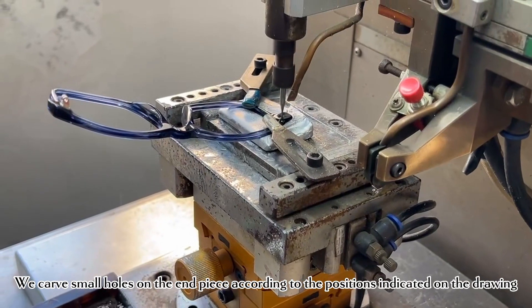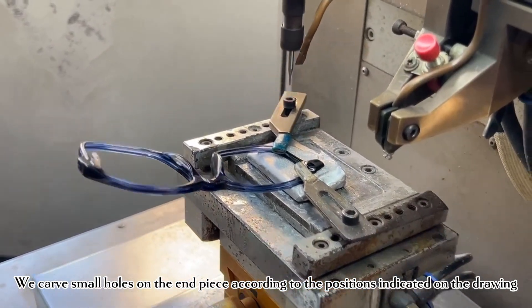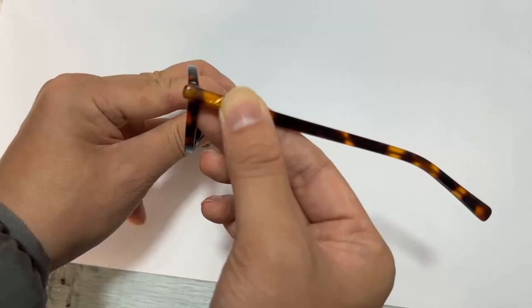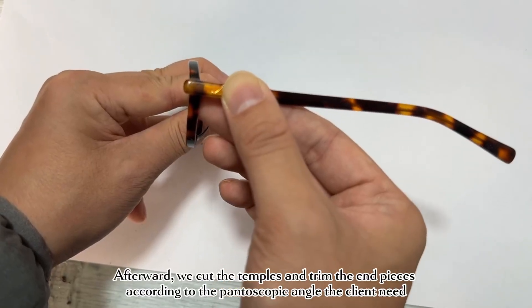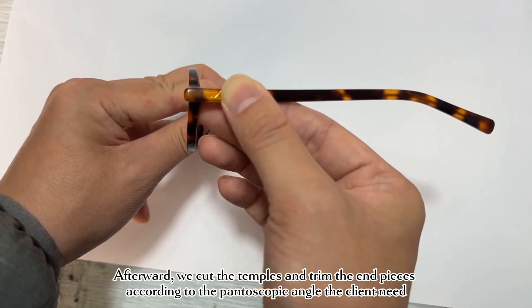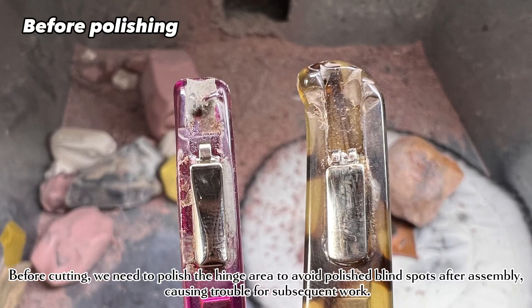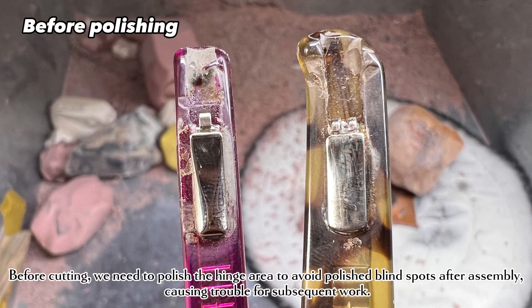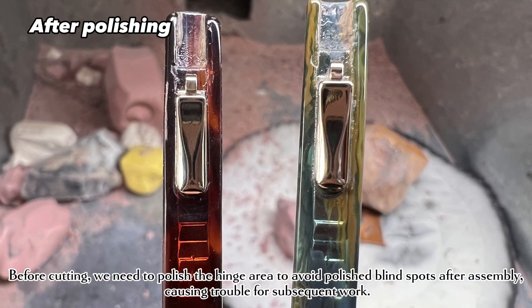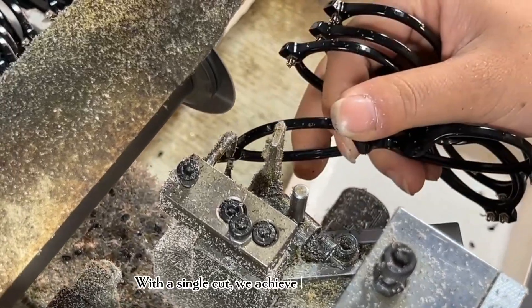We carve small holes on the end piece according to the positions indicated on the drawing, then insert the heated hinges. Afterward, we cut the temples and trim the end pieces according to the pantoscopic angle the client requires. Before cutting, we polish the hinge area to avoid polishing blind spots after assembly, which could cause trouble for subsequent work.